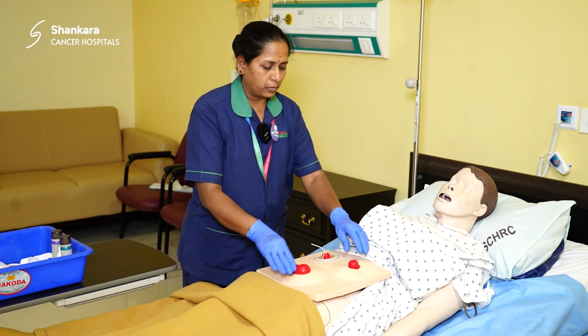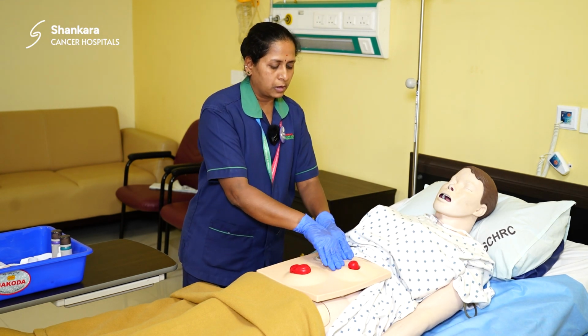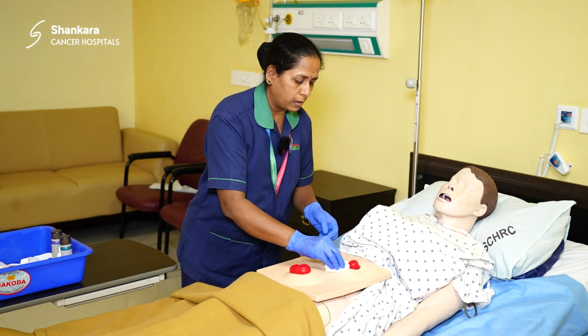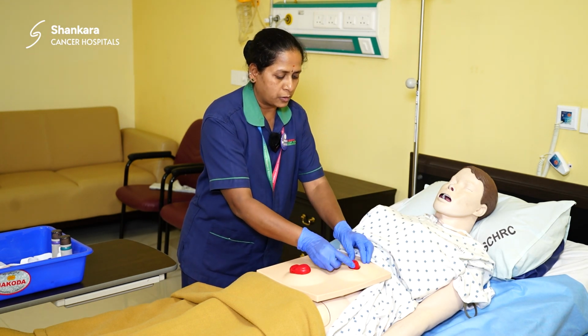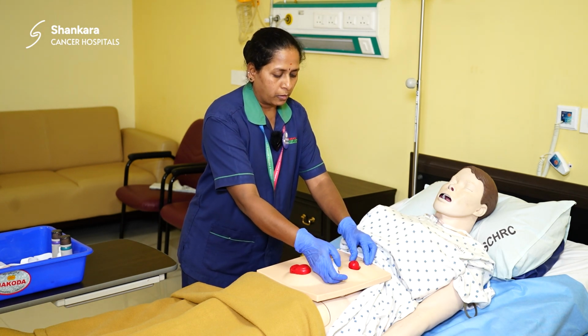Now I am going to apply the bag. Before that we should clean the skin part. So take a wipe, then clean around the stoma so that the skin is clean and dry. At that time we should also observe the stoma color and the stoma output.